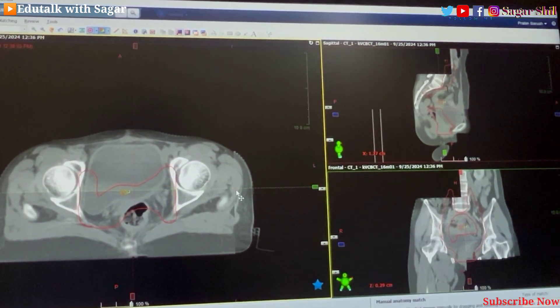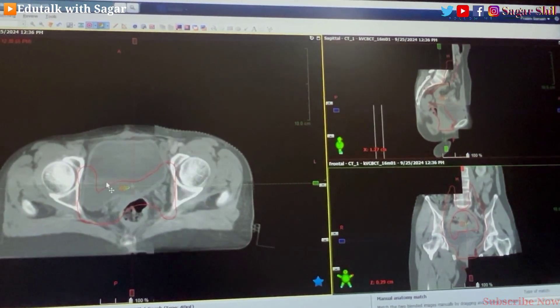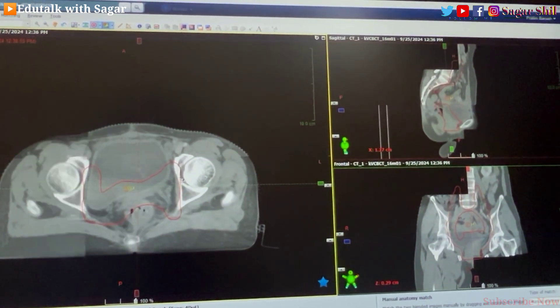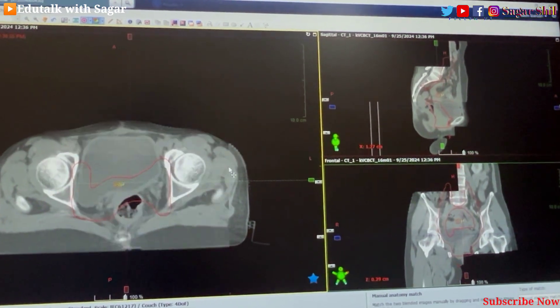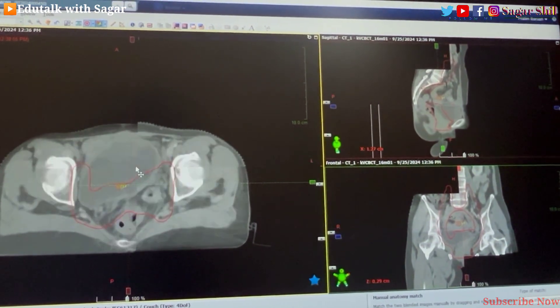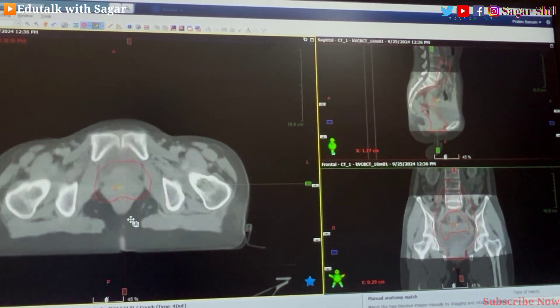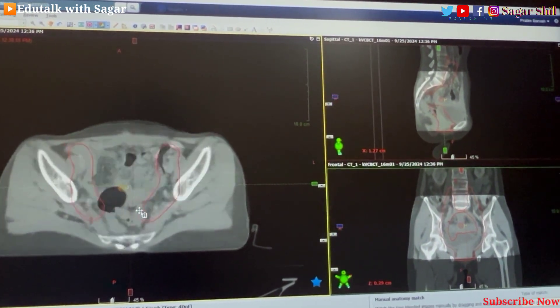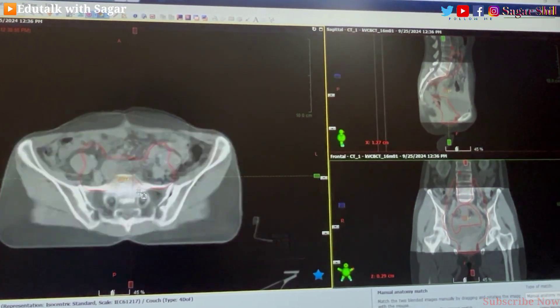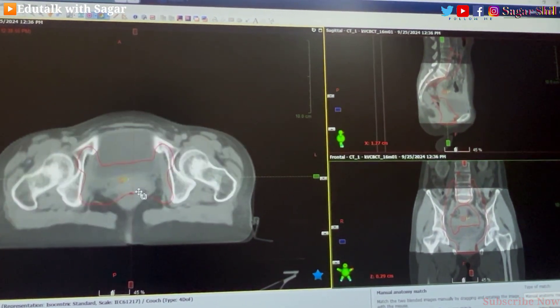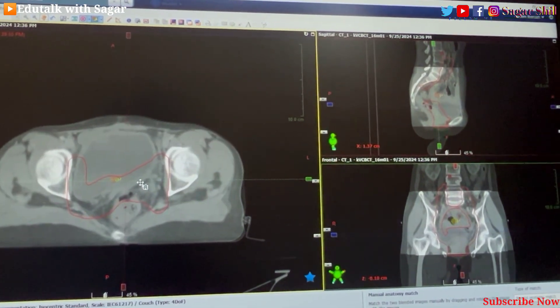This one is the bladder. The bladder protocol should be followed — if it was followed during CT planning time by the therapist, then during treatment time the same protocol should be followed. Sometimes bladder full and rectum empty — this is the main protocol we should follow in cervix and endometrium cases.